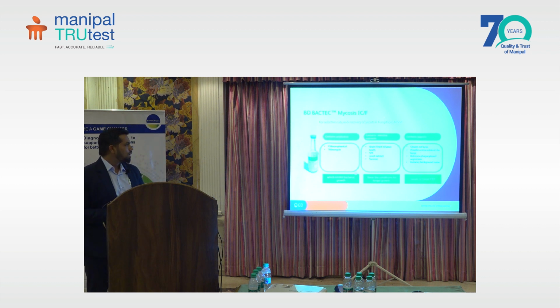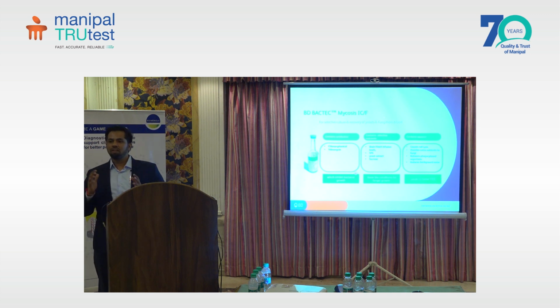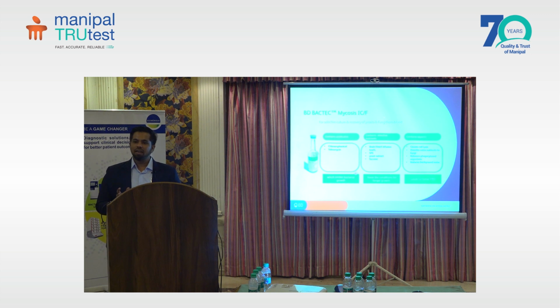And another media is the Bactec Mycosis ICF media. Sometimes in polymicrobial sepsis, there is co-infection of bacteria plus fungal infection. For specific recovery of fungus, we need to inhibit the bacteria which are growing in that. So for that, this media is recommended. This media contains chloramphenicol and tobramycin. This will inhibit the bacteria and increase the yield of fungus.